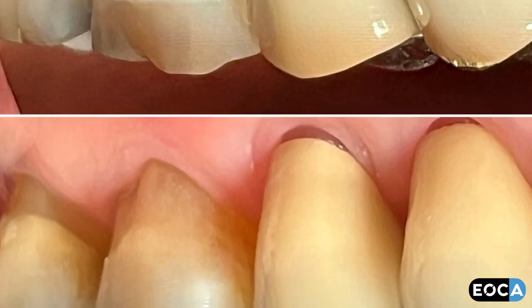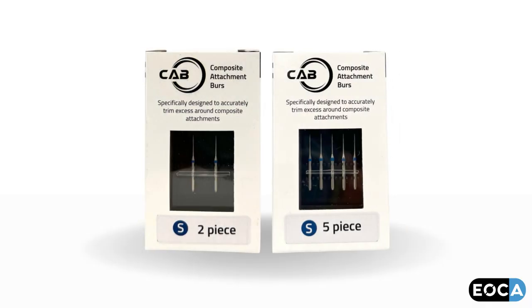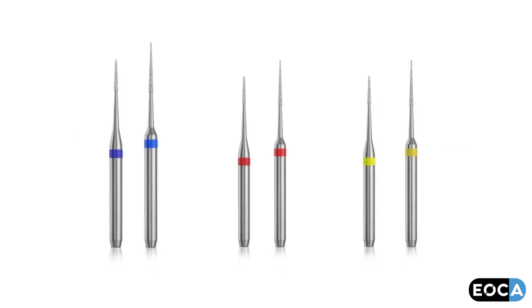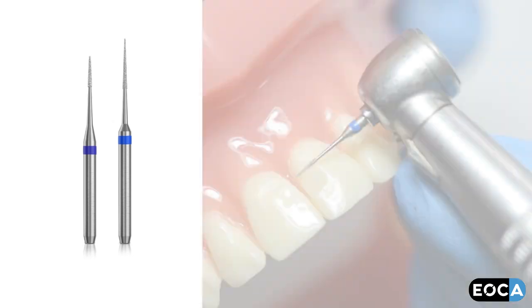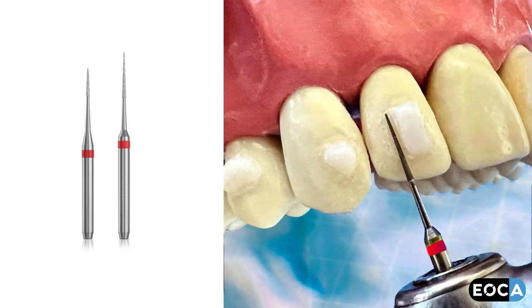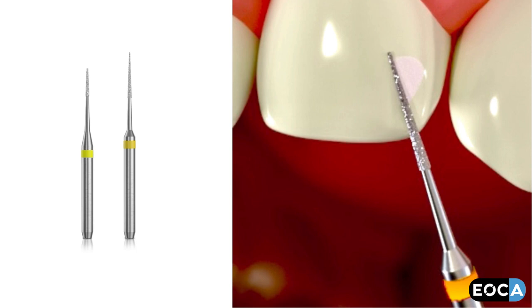Ensuring that no residual resin is left on the enamel, which may impinge upon the seating of the aligner. The burrs are delivered in packs of two or five, in two sizes — 3.5 millimeters and 6 millimeters — and three grits depicted by different band colors: blue, red, and yellow. A blue band burr is for rapid reduction and removal of excess resin; a red band burr is for initial finishing of excess resin and enamel; a yellow band burr is for establishing a high polish of the enamel.